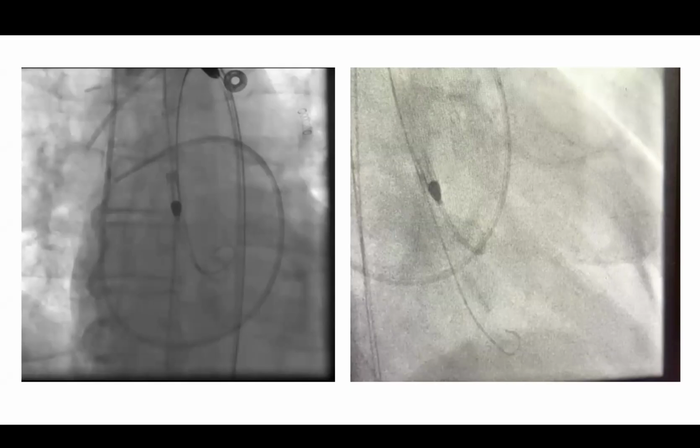Correct. The question is, if a patient's crashing and you can't push that right across, it seems the quicker way to bail yourself out is to rewire this, put in the sheath and put in a new Impella, which is probably going to be a lot quicker than a more complex snaring, doing other stuff, which you used to have to do with the old Impellas where you couldn't rewire the sheath.